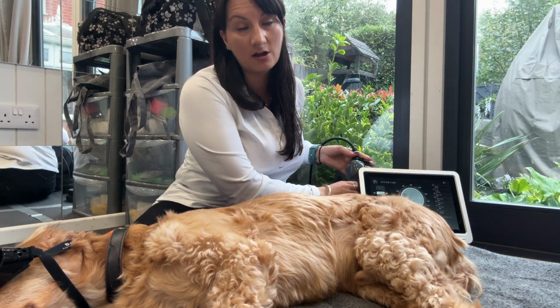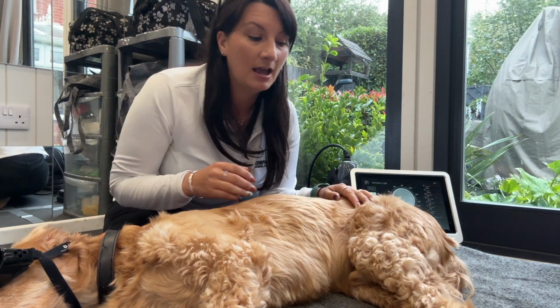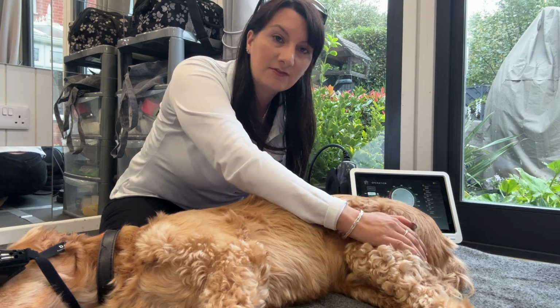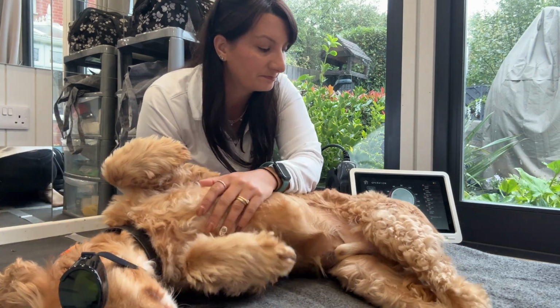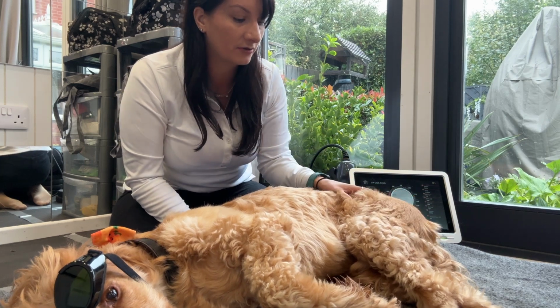If I'm going too slow, it will alert me. And if I'm treating at the right speed, then it will tell me that it's happy at the speed I'm going, which means that I'm going to dose my tissue evenly across the area that I'm treating. And I know that that area is going to get the right dose. So that's why I personally love scanning, because you can cover a larger area.